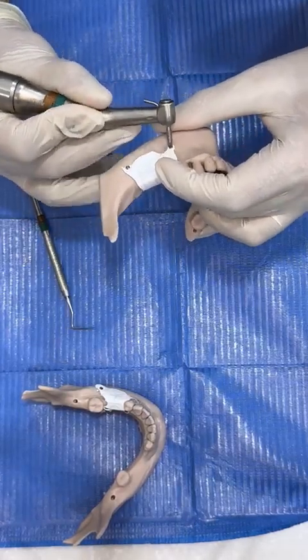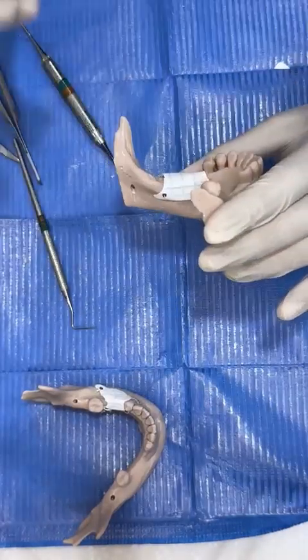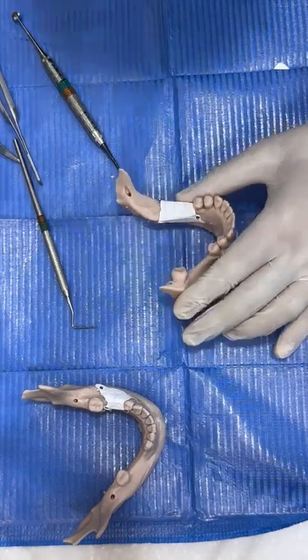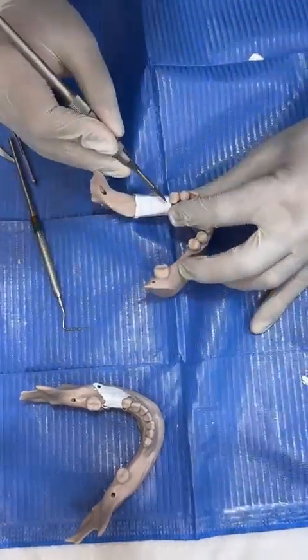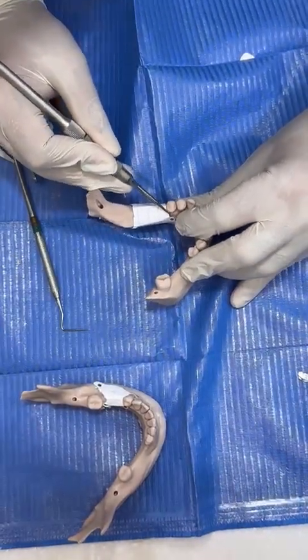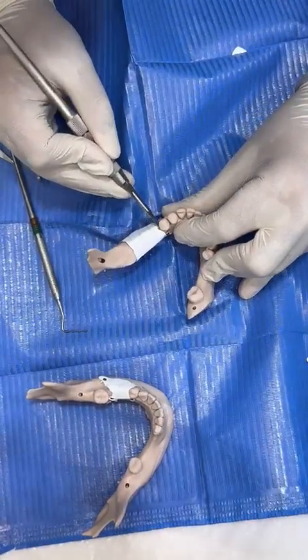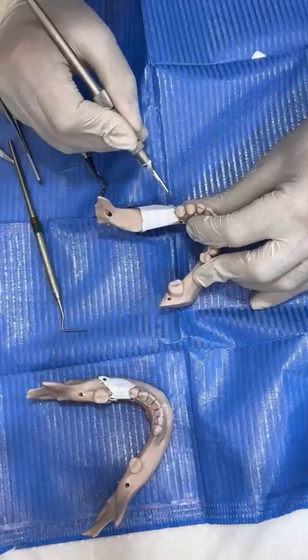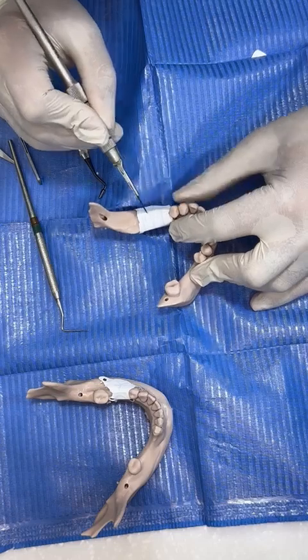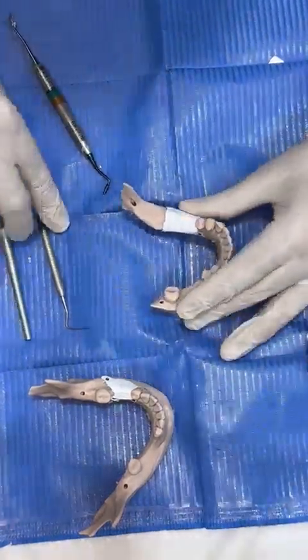Okay. Now I have fixed the membrane all around. If you want to remove any excess, you can use your blade after you fix the membrane. If it's touching, for example, adjacent teeth, and I want to remove some from here, I can use the blade and cut any contact. It shouldn't be in contact with adjacent teeth. There should be around 1 to 2 millimeters of even space from the adjacent tooth. Any graft touching should be removed.